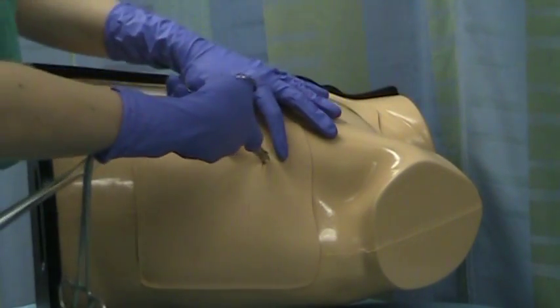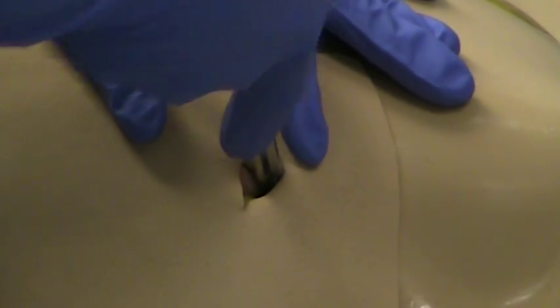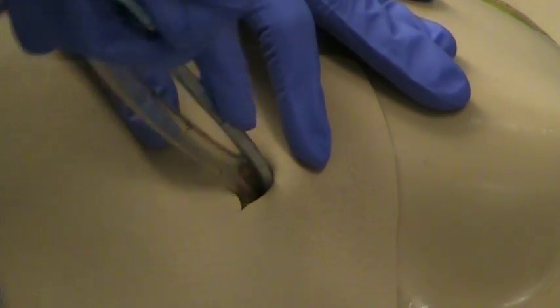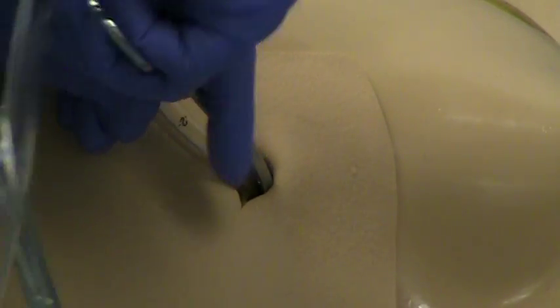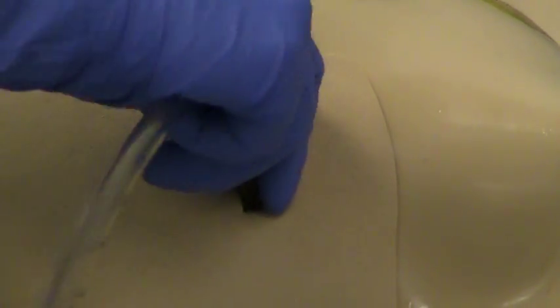So go ahead and clamp. Find my track again. And once I get my tube in, pull my clamp out. And insert my chest tube in.